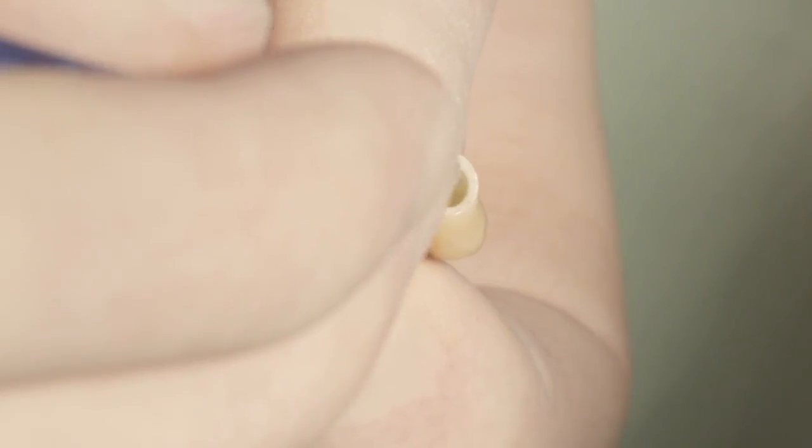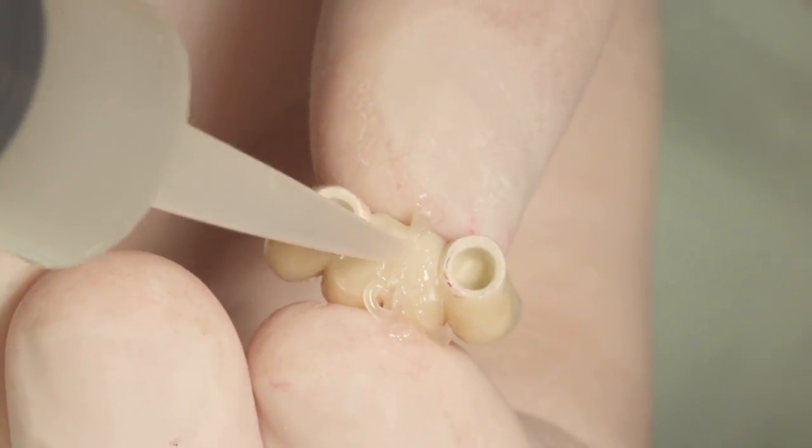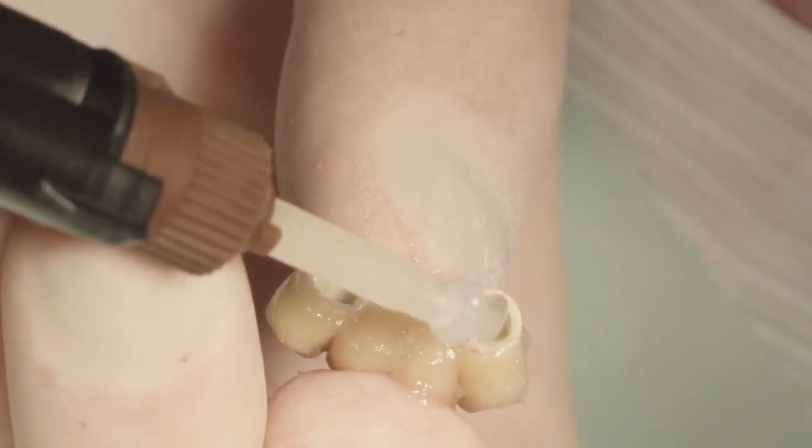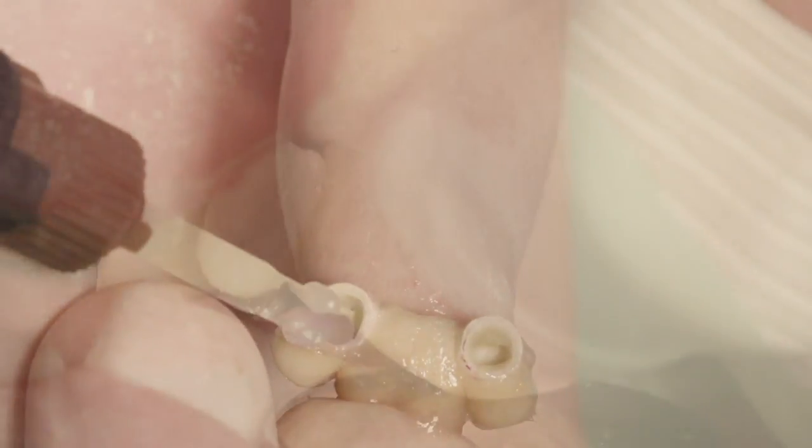A silane solution is applied to the bores of the prosthesis, and Vaseline is applied to the ridge side of the prosthesis to facilitate the removal of any extraneous cement. Minimal cement is applied to the bores prior to inserting the prosthesis in the mouth.